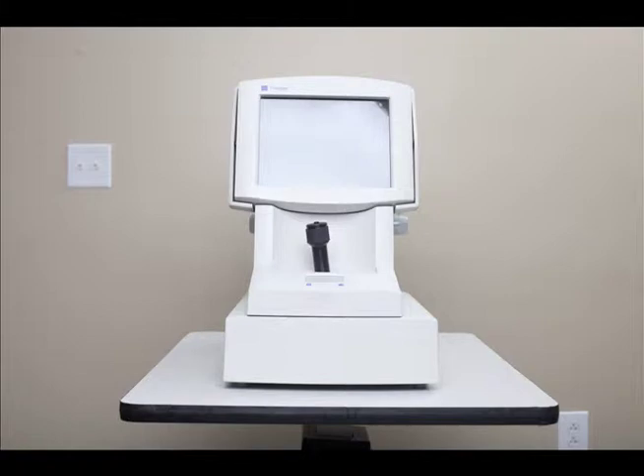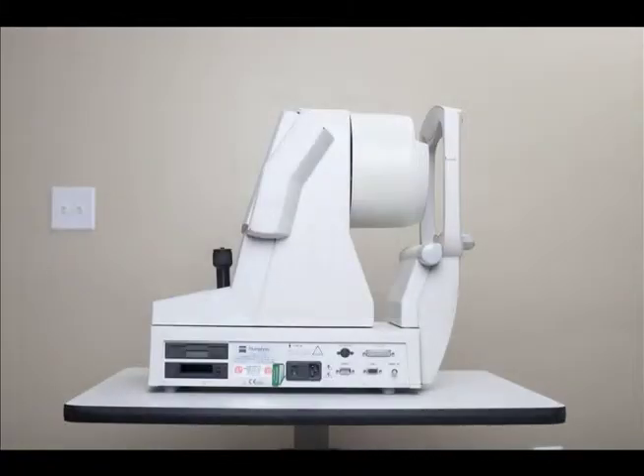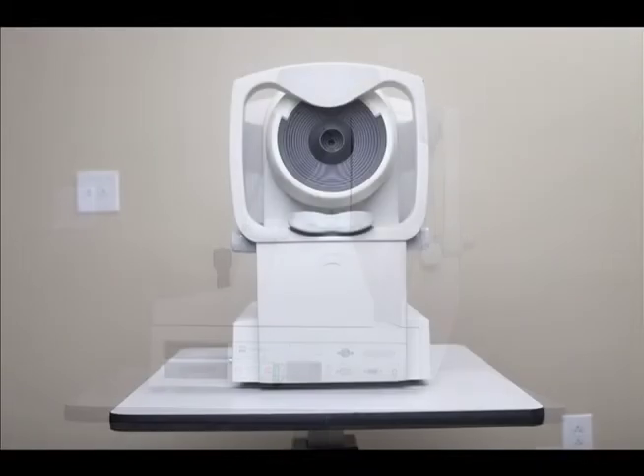We are often asked about the Zeiss Atlas corneal topography. I will go into some detail about how the instrument works. The Atlas topography system is ideal for primary care, contact lens fitting, pathology detection, and corneal refractive surgery management.